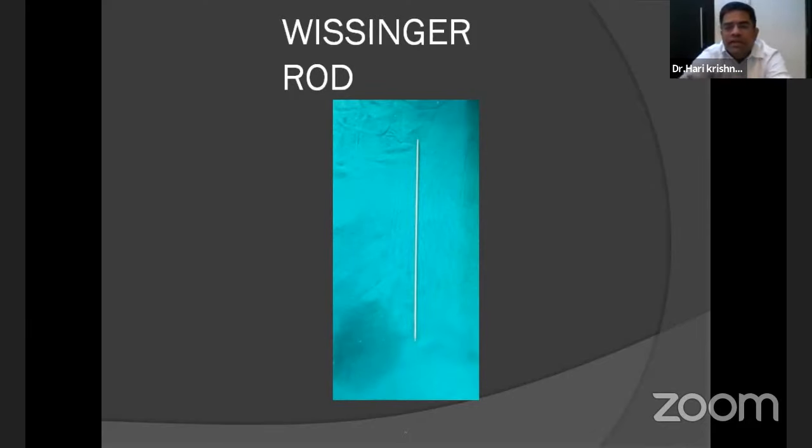I use a Wissinger rod so that I can exchange my trocar sheath to the plastic cannula and from the plastic cannula to the trocar sheath. So the Wissinger rod is very, very important for shoulder arthroscopic surgeons.